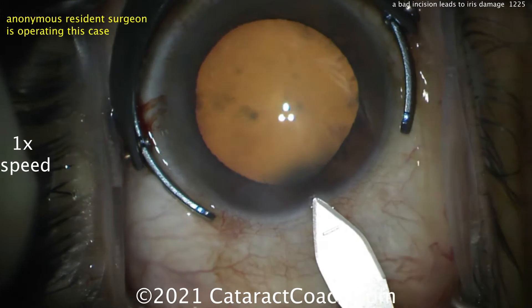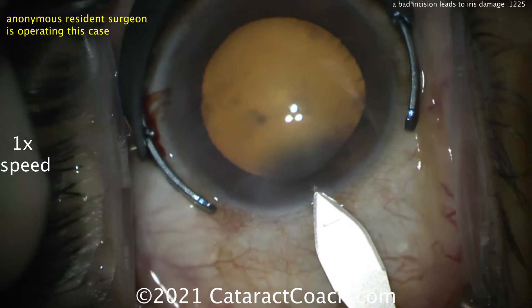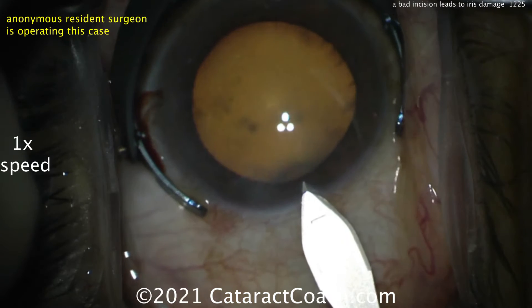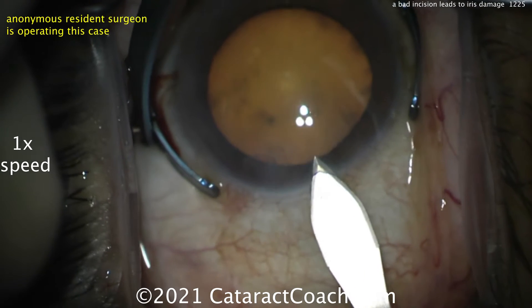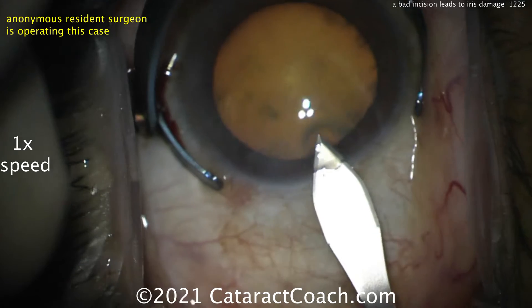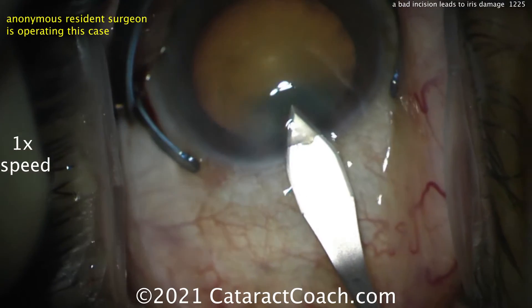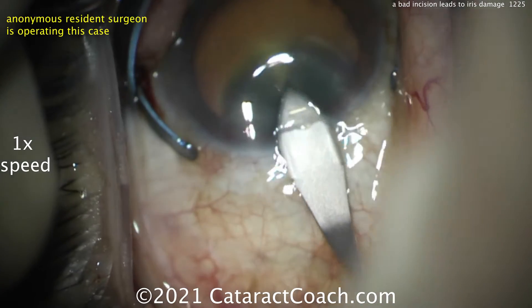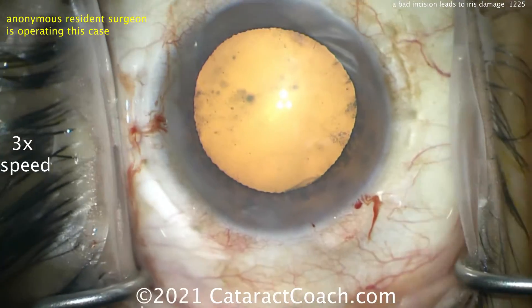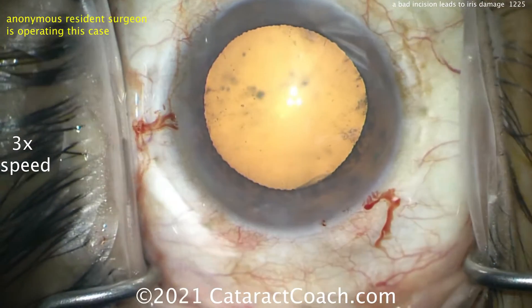The issue is the resident is going to push the keratome into the eye way too far, and then when retracting the keratome, he's going to saw to the right and enlarge the incision. Here comes the incision — looks okay for now. But watch as the keratome goes in the eye. Watch carefully — why go in so far? You saw that sawing motion laterally to the right-hand side.